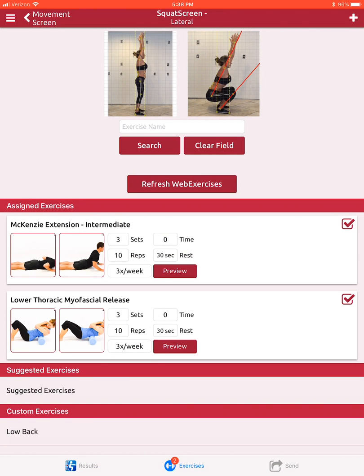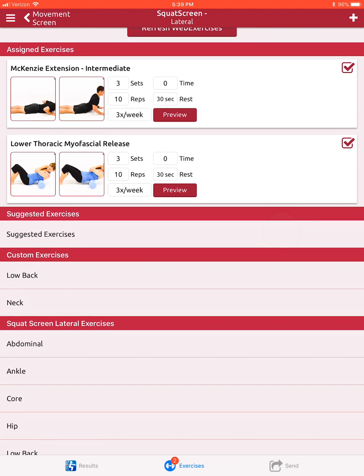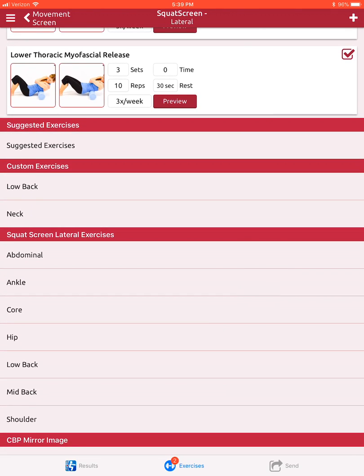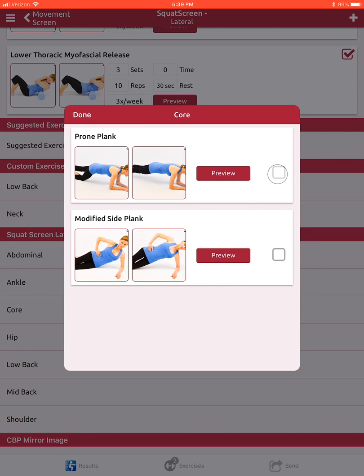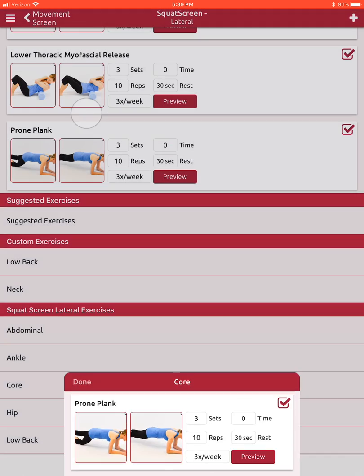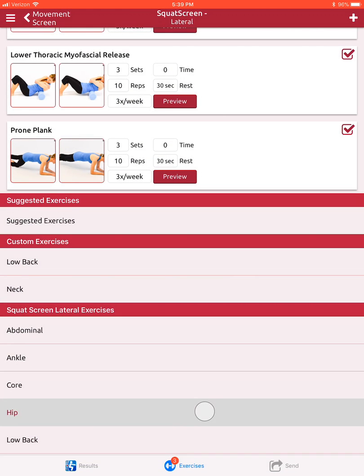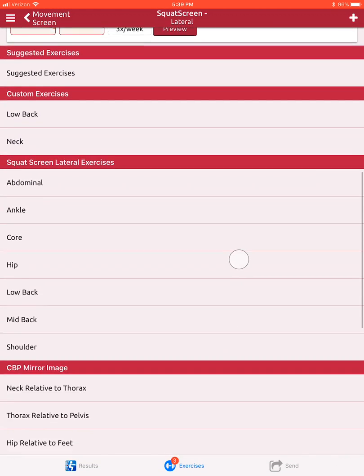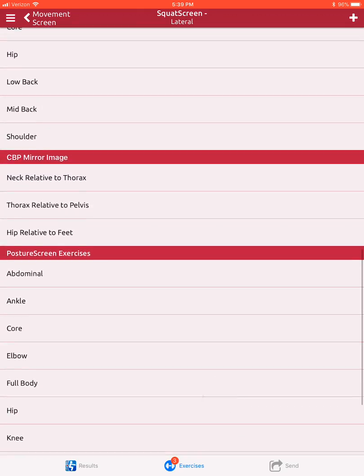Those are correctives that the client or patient can do when they're outside the facility on their own time. If I wanted to scrub through and select something else, I could add a core exercise or any sort of custom exercises as well.